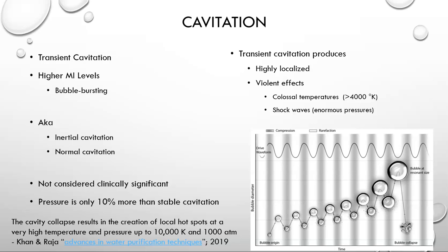Transient cavitation at high mechanical index levels results in bubble bursting. This is also known as inertial cavitation and normal cavitation. It's not considered clinically significant. However, it can occur when the pressure is only 10% more than stable cavitation.